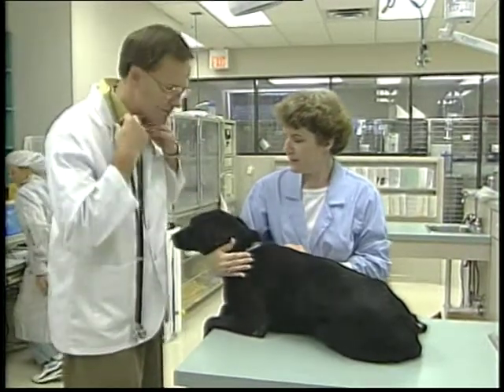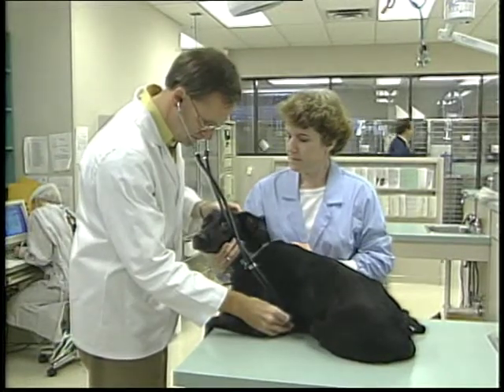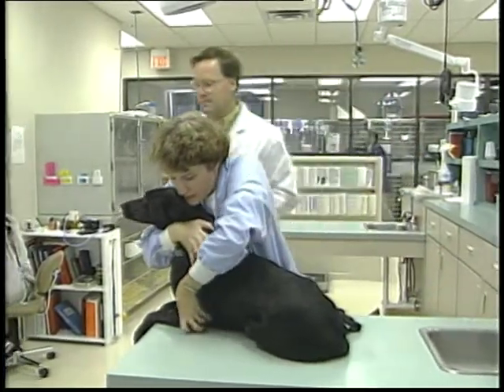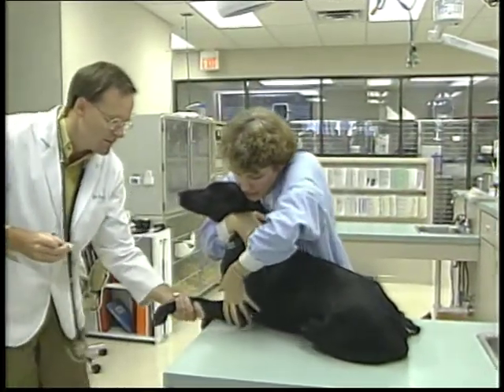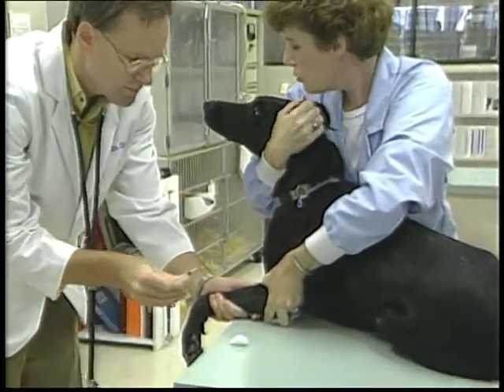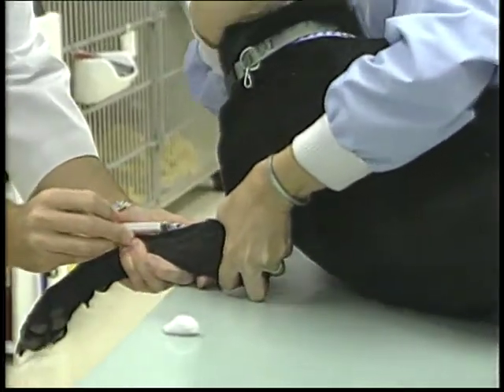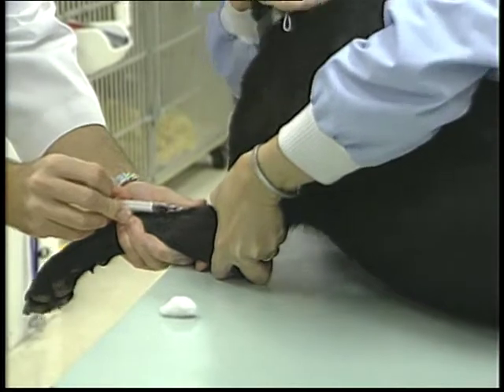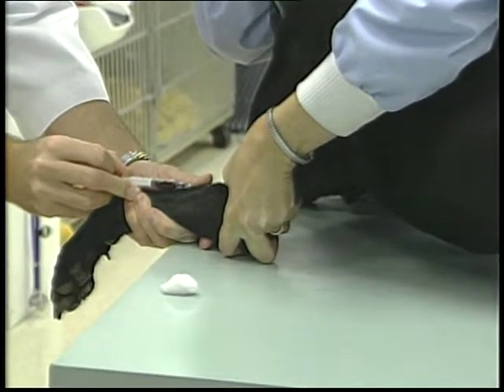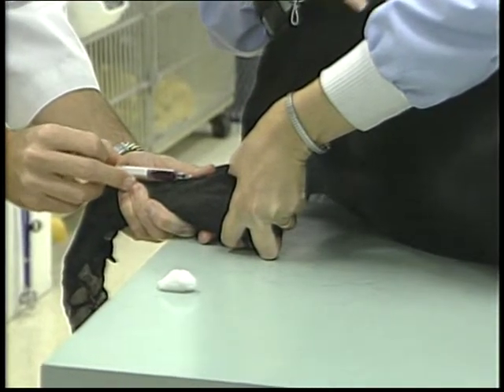When a sick patient comes to your hospital, they are unable to voice their illness as we might do. Instead, veterinarians rely on the use of diagnostic tests, along with a thorough physical exam and an accurate history from the owner to uncover the exact illness the pet might have. The diagnostic tests veterinarians perform often include evaluating tissues and fluids of the body. Blood, urine, and feces, the three specimens we will study in this program, often reveal amazing amounts of information to the veterinarian as to what is happening within the sick pet.